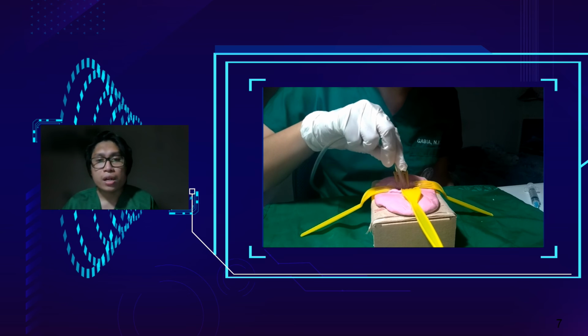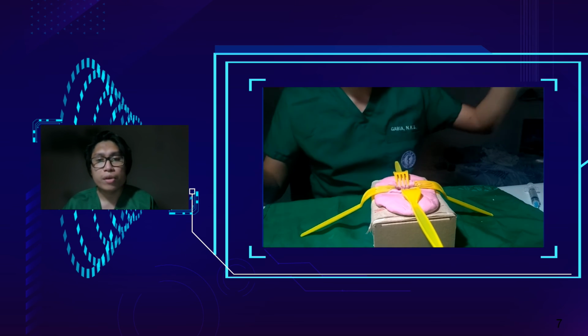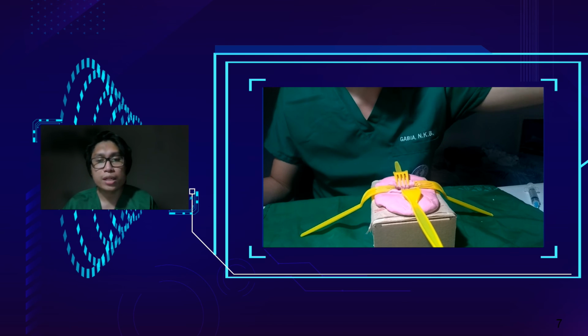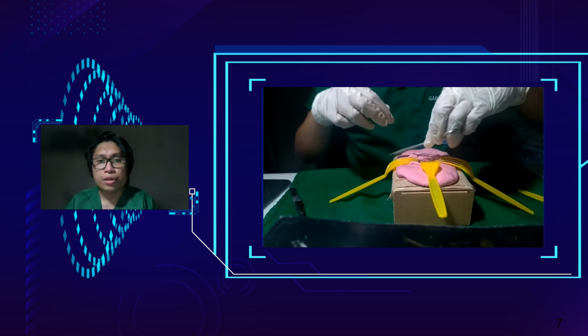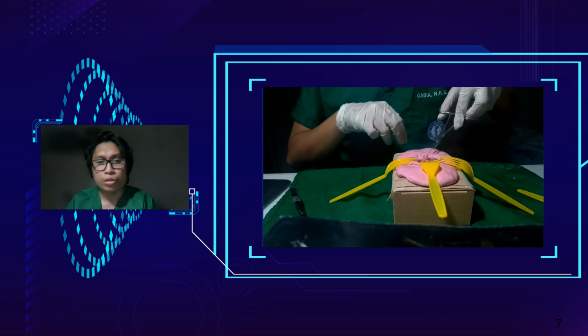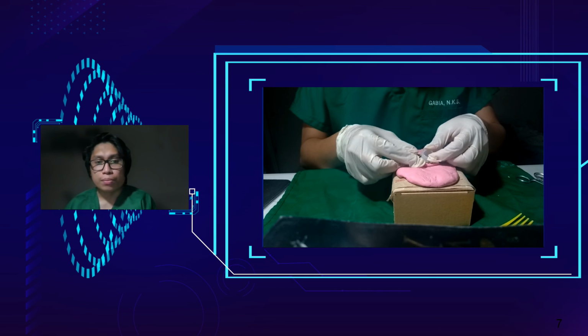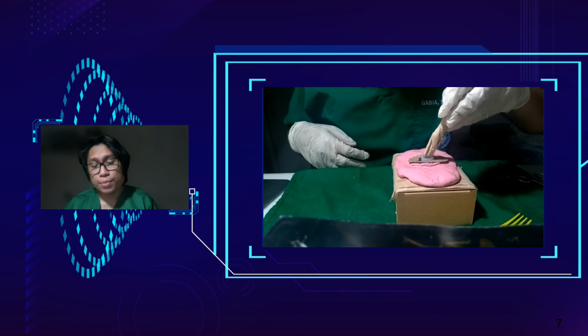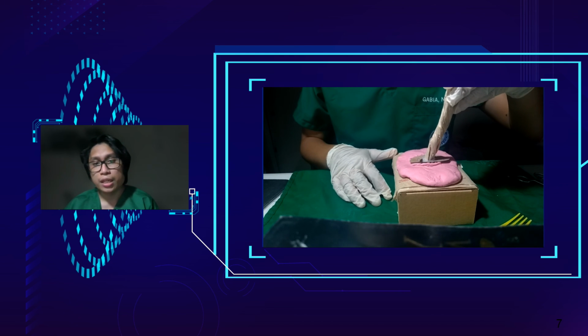Ensure that the cervical field is completely dry before proceeding, as it is difficult to achieve hemostasis once the tracheostomy tube has been inserted. A silk traction suture is passed through the anterior tracheal flap and loosely secured to the skin. Insert the introducer into the tracheostomy tube. Ensure that the tube has been inserted into the tracheal lumen and not into a false passage in the paratracheal soft tissues.